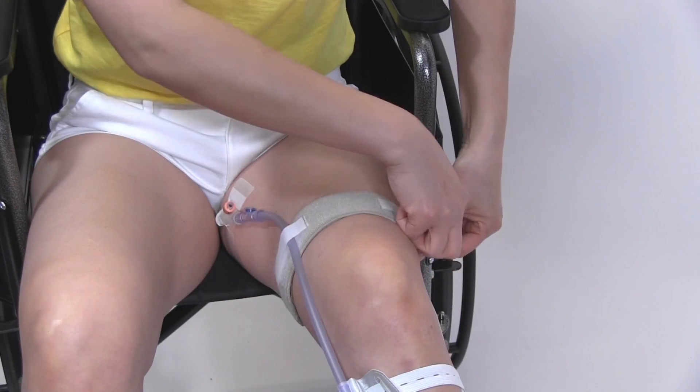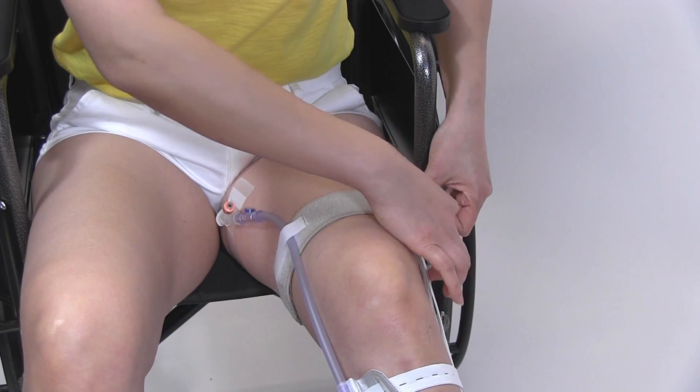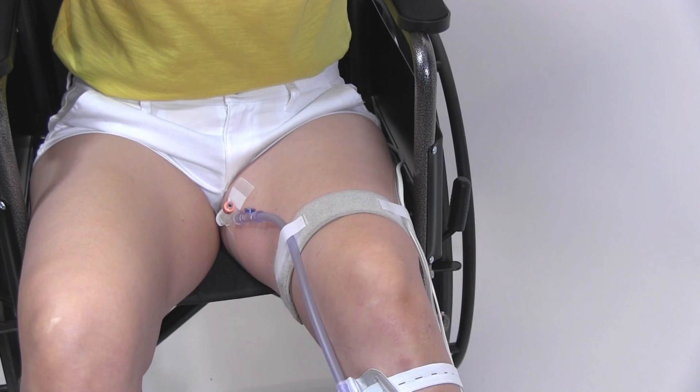Use the thigh strap to secure the discharge tube and the controller power cable. You can adjust the thigh strap as needed.